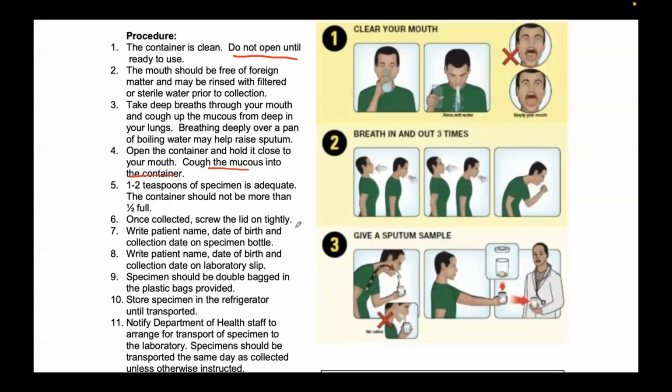Write your complete details doon sa pinakabote. And then you may submit it in the laboratory. Specimen should be double bagged in the plastic bags provided. Store the specimen in the refrigerator until transported.